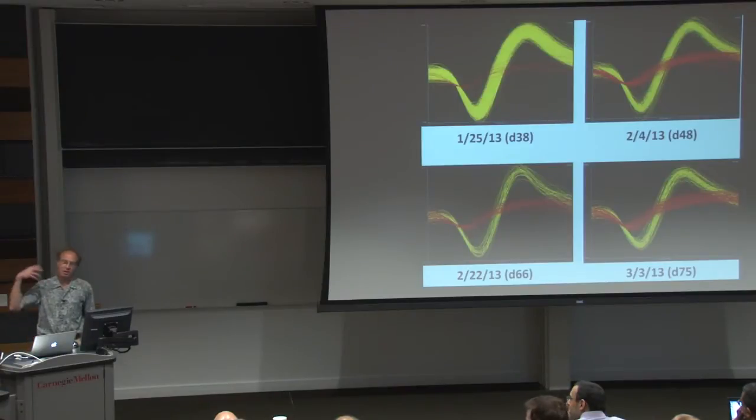And there are also different types of electrodes. It turns out if you make the electrodes of a diameter that's less than 6 microns, the system tends to ignore that. And so you don't get any of these reactions. You can make them very flexible, so you have better tissue compliance, avoiding mismatch. There are a number of things that are being done to advance that.